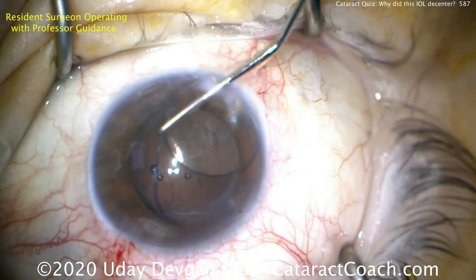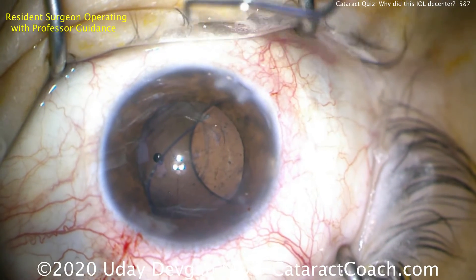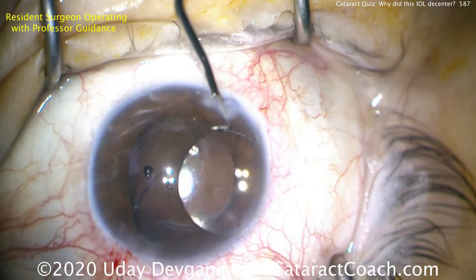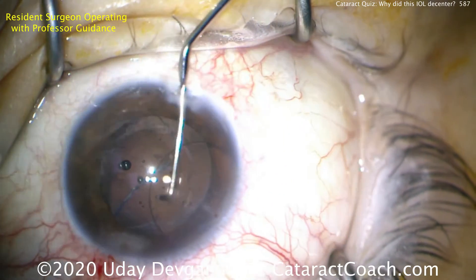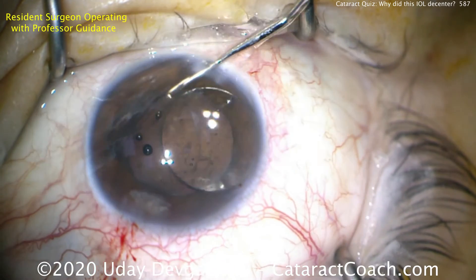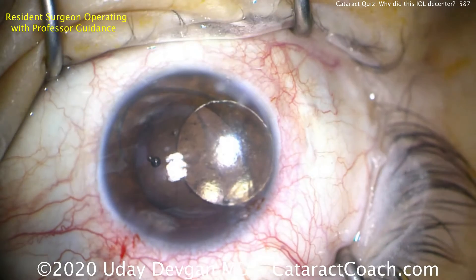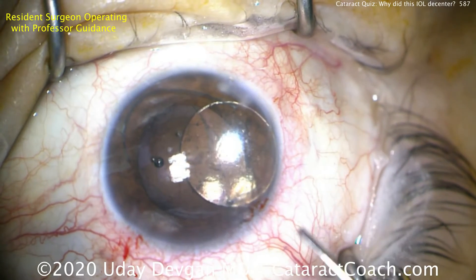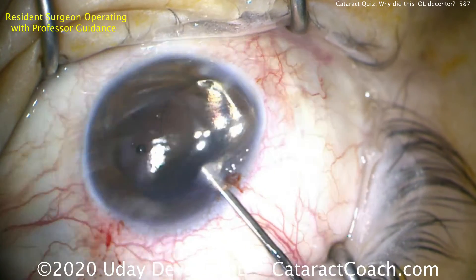There's an optic and there's one haptic, but the entire other haptic is missing. Is it in the eye? We asked the original surgeon and he said that on insertion of the IOL, one haptic was broken off, and his decision was to leave it in the eye with one broken haptic. Initially it stayed reasonably centered, but when the capsular bag contracts one or two months after healing, you end up with this situation — a very de-centered lens.